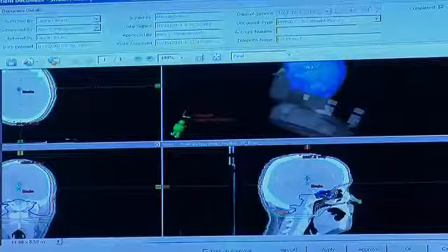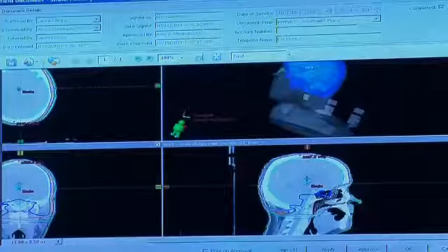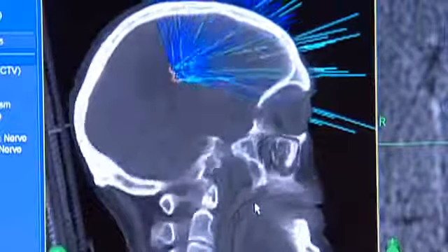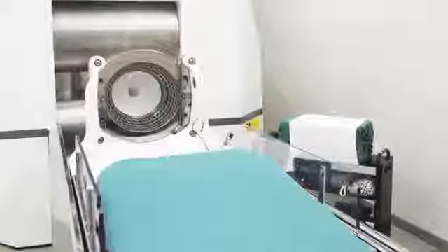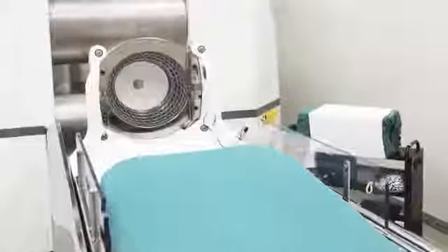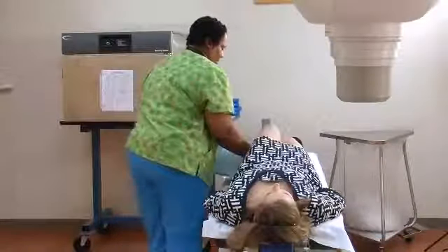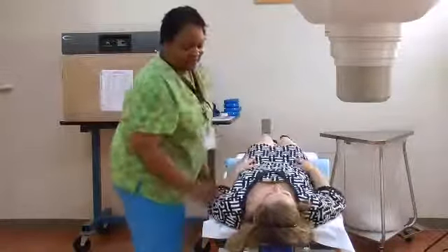The major difference between Gamma Knife and CyberKnife from the patient experience is the fixation or the immobilization of the head during the procedure. With the Gamma Knife, that requires an application of a head frame, which is literally attached to the skull. With CyberKnife, the mask is very comfortable and there's really no untoward effect of wearing the mask. If you look at surgery versus radiosurgery, the radiosurgery is definitely less invasive. There's no anesthesia. They're just resting comfortably in the treatment facility. The treatment's delivered, it's painless, and they go home the same day.